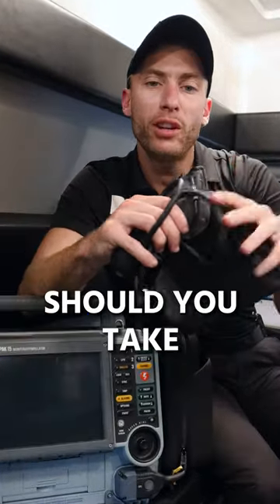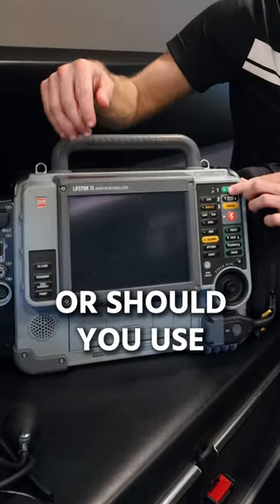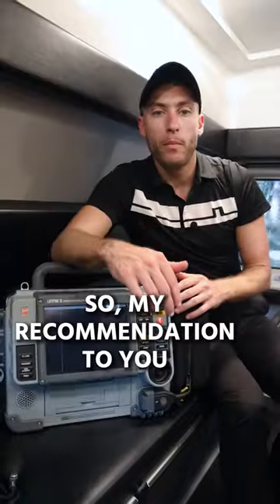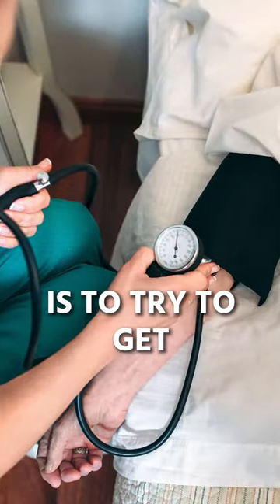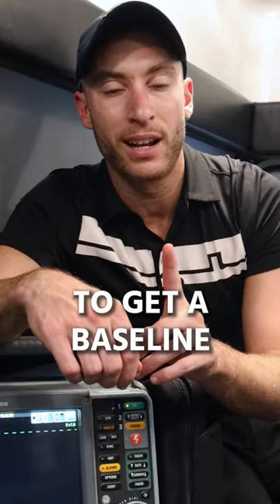A lot of people wonder: should you take a manual blood pressure with a cuff like this, or should you use the blood pressure that comes on the LifePack? Which one's better? My recommendation is to try to get a manual blood pressure first to get a baseline, if possible.